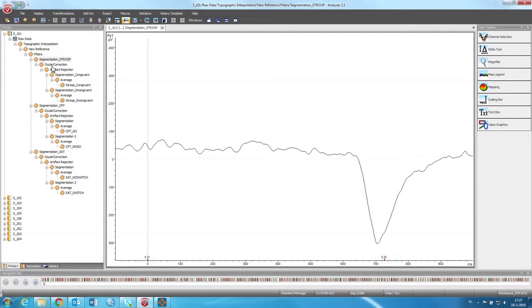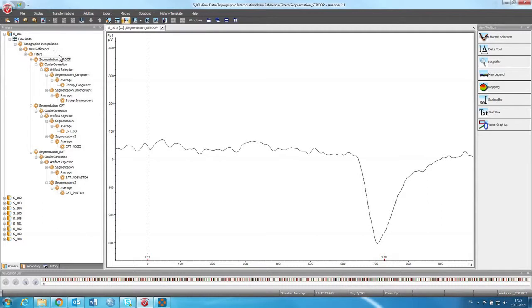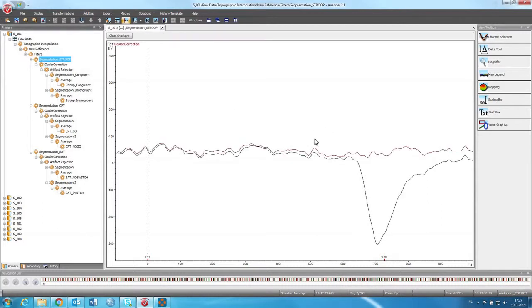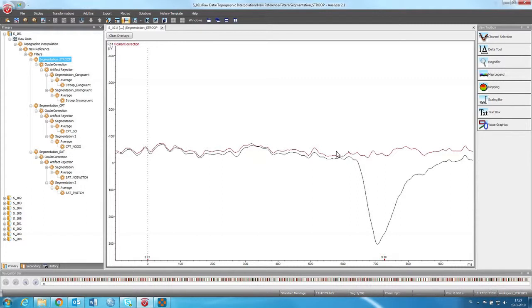And preferably we want to get rid of it and have the normal data without the eye blink. And that's possible with ocular correction. So with ocular correction you select the eye electrodes that were in your data. And then with computation, you can remove this eye blink. And we can look at this by grabbing this and putting it over here. So we have an overlay. And here you can clearly see really nicely that the eye blink was corrected. So it's removed from the data, which is really nice.